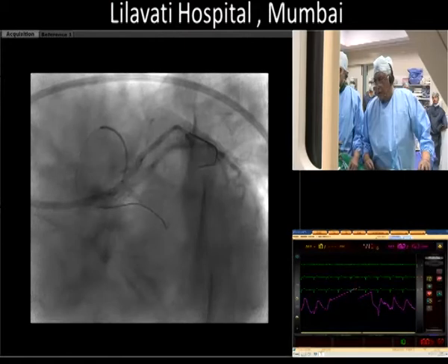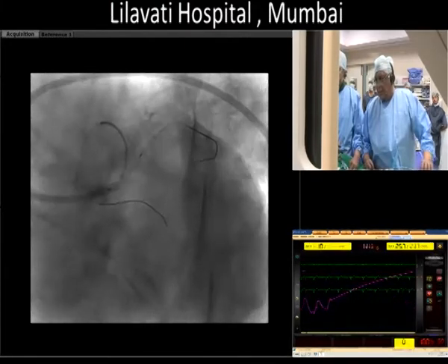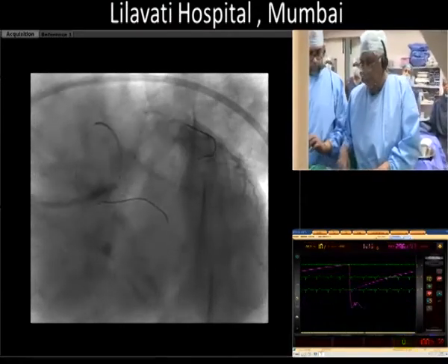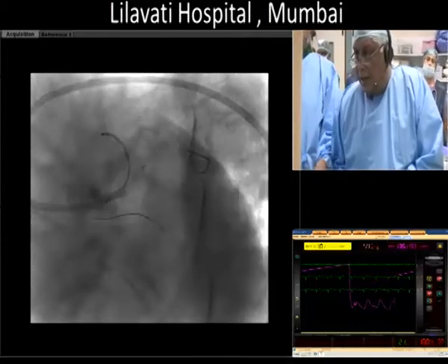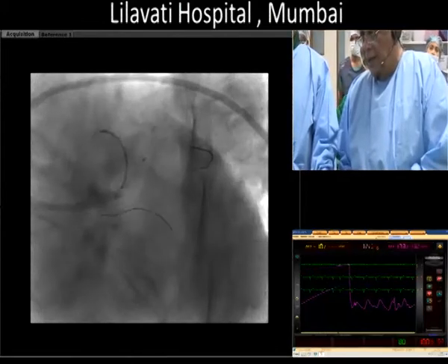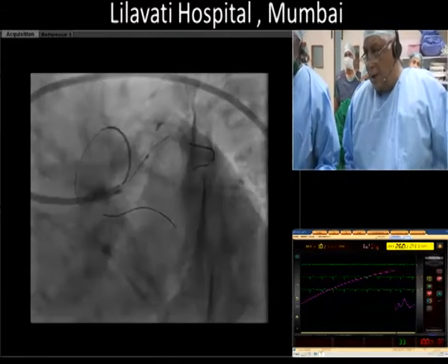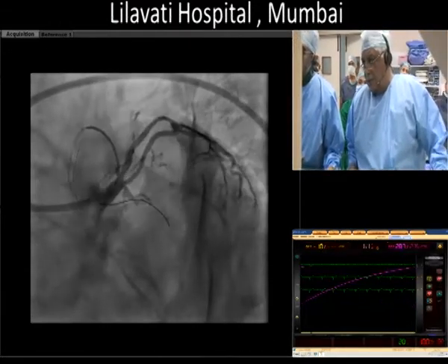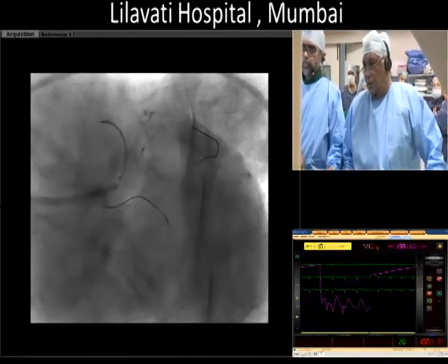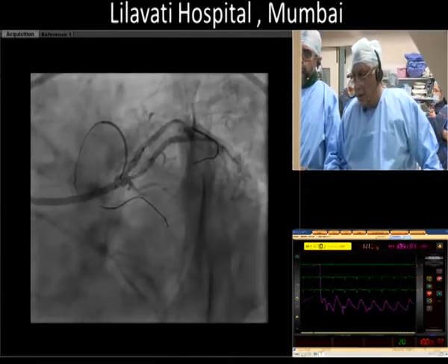So again, the stent placement in relation to the marker is a very important issue which we tend to forget. All the Abbott stents are on the marker, whereas the Boston stents are 1 millimeter away from the marker. So positioning becomes a major issue. Yeah, I think the BioMime is right on the marker. I know that.